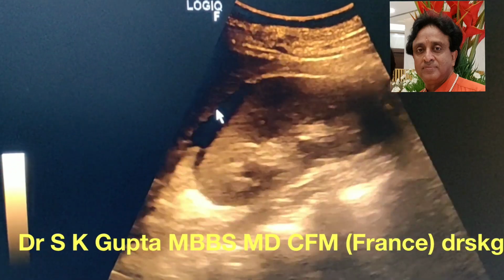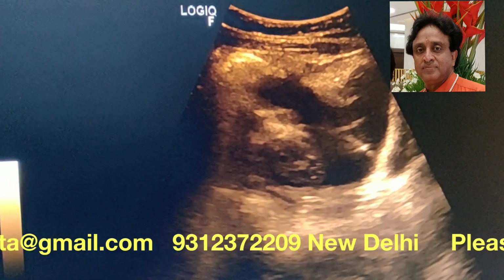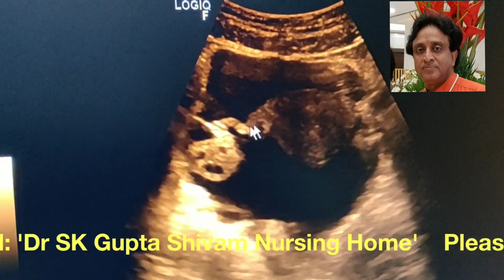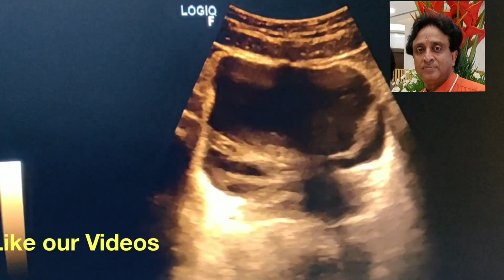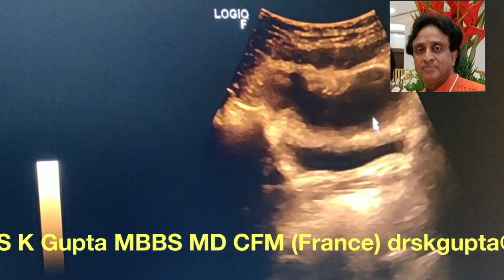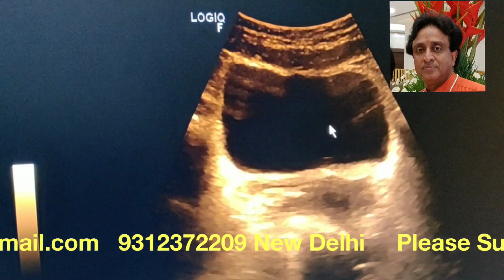And now we go down below into the abdomen, and we find that there is free fluid in the abdomen. You can see that this is the uterus, and this is the ovary, and this is the adnexa, and there is free fluid around here. And if I tilt my probe down below, I can see that this is the urinary bladder. Previously it was giving the impression that this is the urinary bladder, but this is not; down below is the urinary bladder, and here is the free fluid in the abdomen.